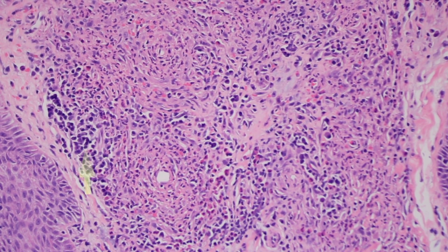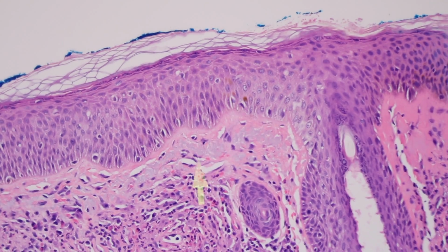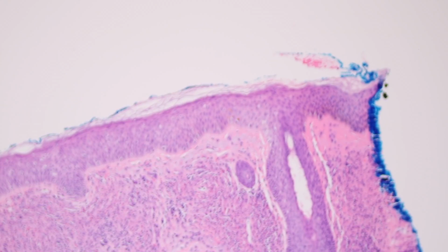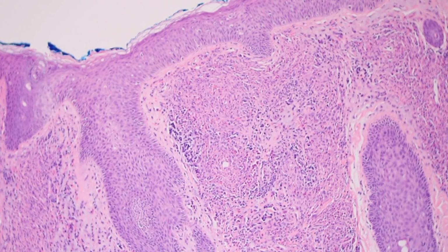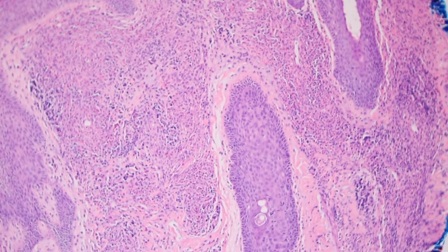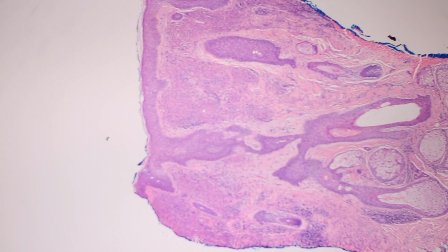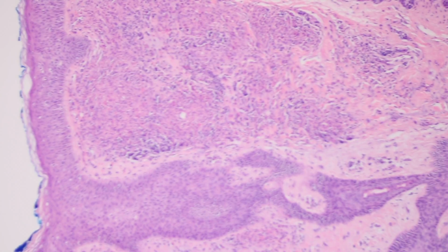In the background, you can still see the plasma cells, you can still see EOs, you can still see that Grenz zone separating the epidermis from the dermal infiltrate. So it still fits nicely for granuloma faciale, and clinically it did too. But this is a good example that in G faciale, sometimes you can have what's called a fibrosing vasculitis or fibrosing vasculopathy with neutrophils.